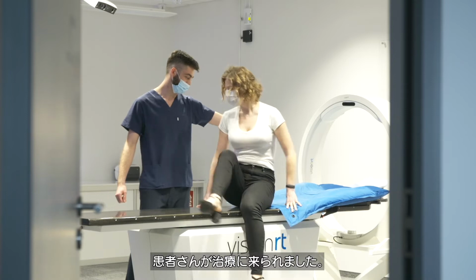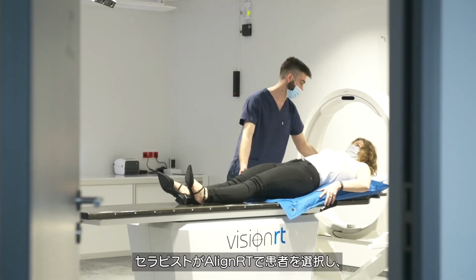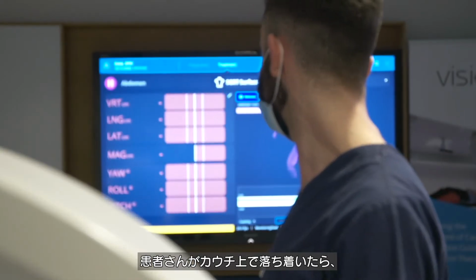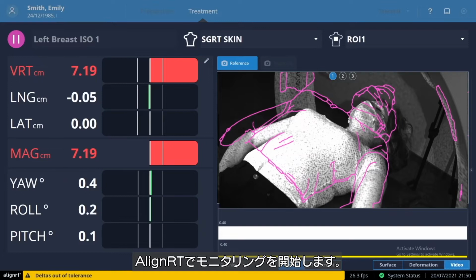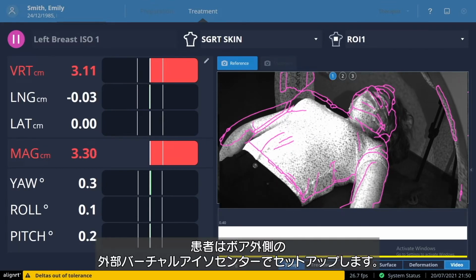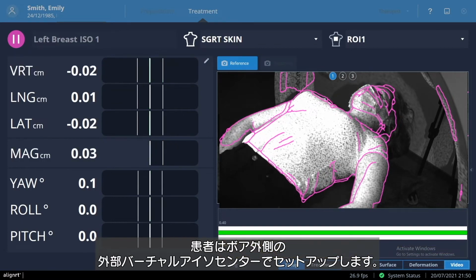The patient has arrived for their treatment. The therapist has the patient selected on AlignRT, and when the patient is settled on the couch, they can start monitoring with AlignRT. The patient is set up outside the bore at the external virtual ISO center.